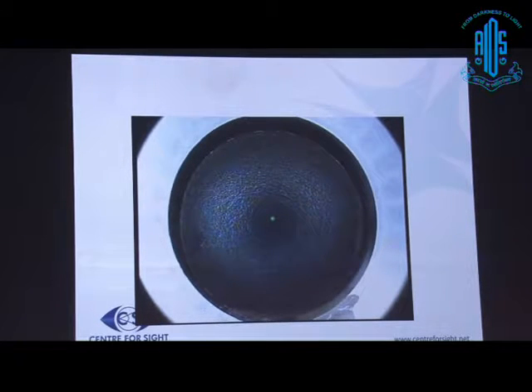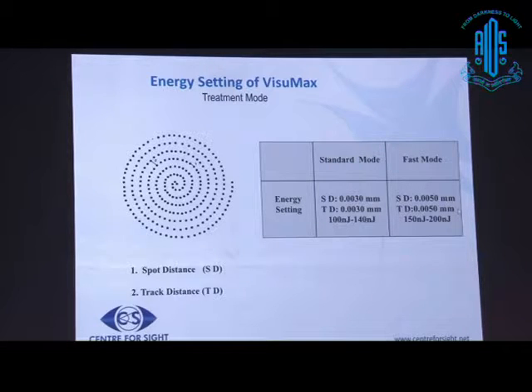The side cut is performed, and once this procedure is over, you can manually lift the flap. Please remember that it is not a dissection like a microkeratome, because there are tissue bridges in between the areas of separation by the femtosecond laser. So in a worst case scenario where the laser has not fired adequately, you will not get a free flap or a buttonhole like with a microkeratome. You can leave the patient as is, and the patient is left from where they started.